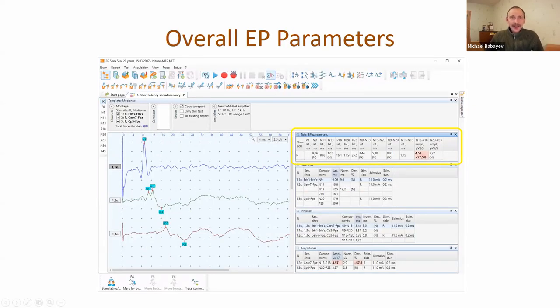We added a new analysis table for evoked potentials - the totalized parameters table. For example, you can record somatosensory evoked potentials with many traces and many markers, and it can be difficult to understand which markers to use for analysis. In this new table there will be only one value for one marker and one patient side. If you have many N9 markers, you will get only one value: minimum latency and maximum amplitude.